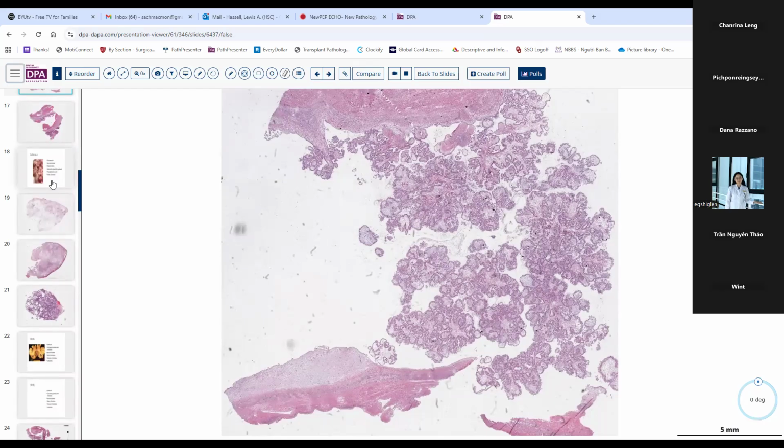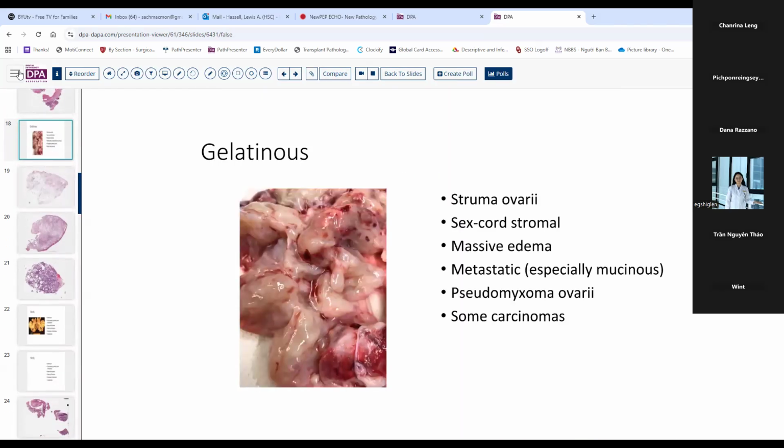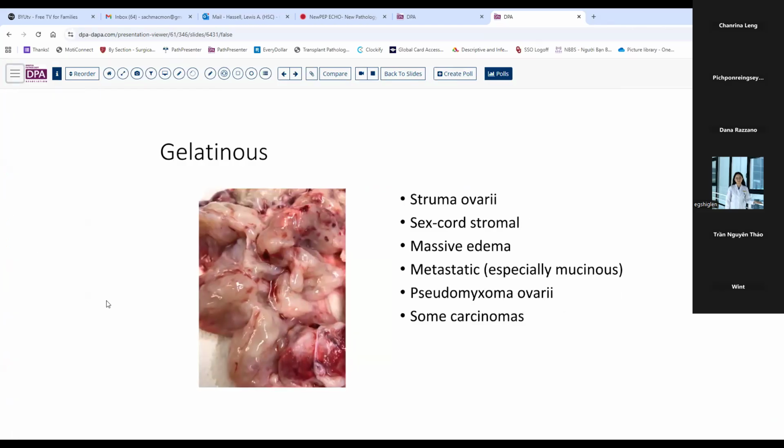Yeah, and I agree completely. So let's look at another pattern, the so-called gelatinous tumors, which have this very glistening type of appearance. Maybe this might also apply to some fleshy tumors where you get a lot of extra fluid, and you can see here it's kind of leaked onto the towel as we've had it on the sample.